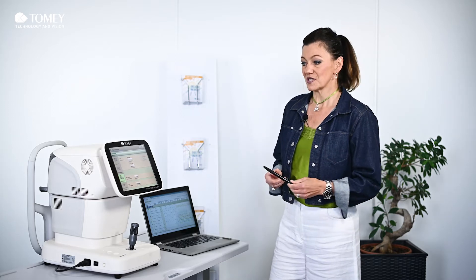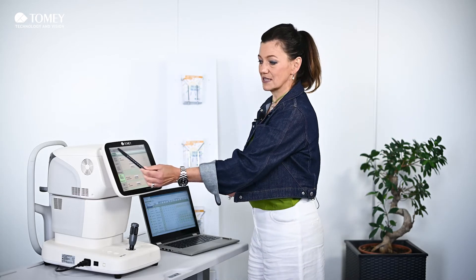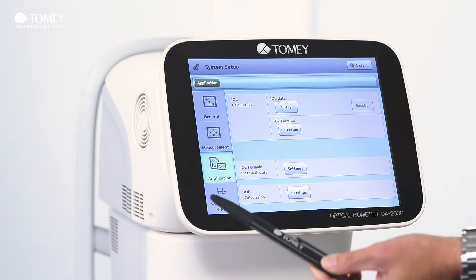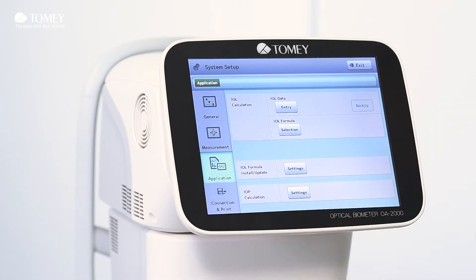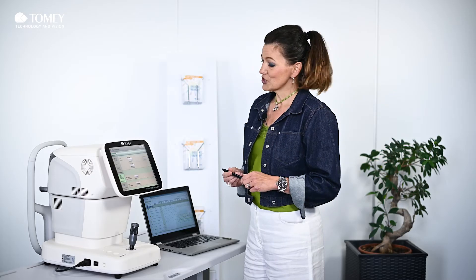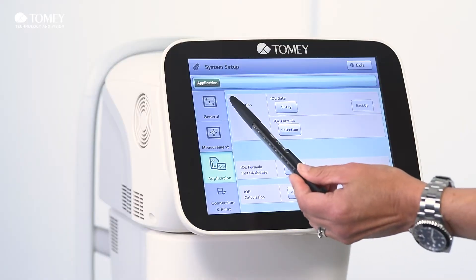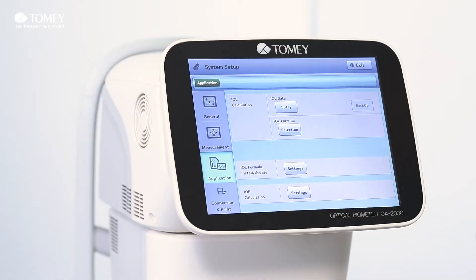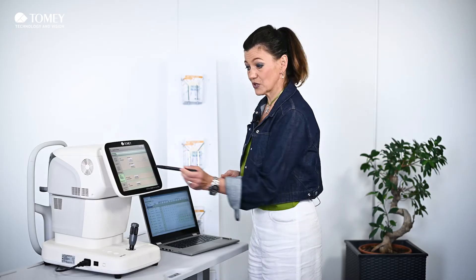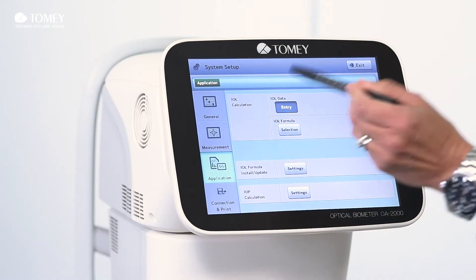For this, you simply go to our system setup, and in the system setup you have an application button. On this application button you can see IOL calculation and IOL data entry. For IOL data entry, you simply click on entry.